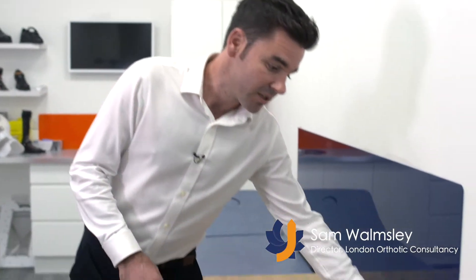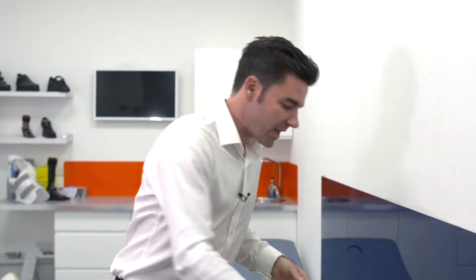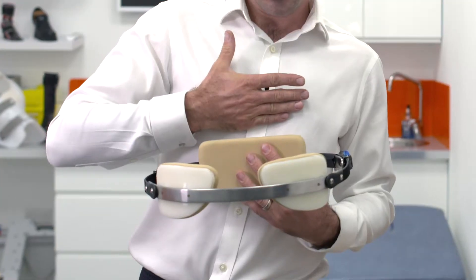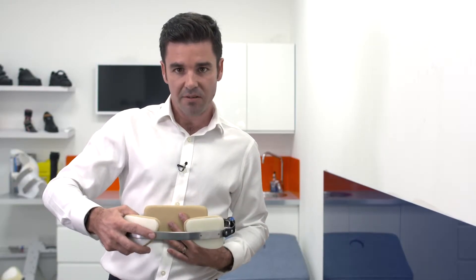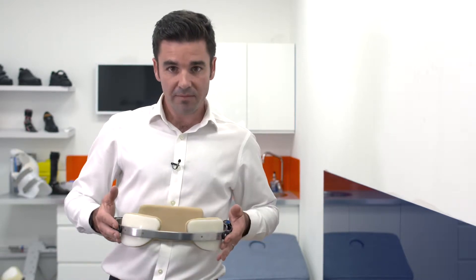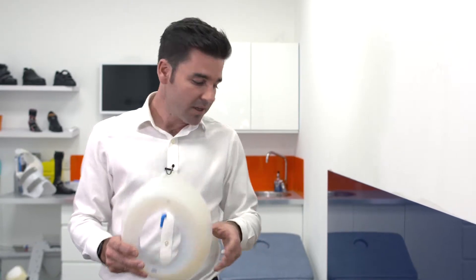With pectus carinatum, we treat with braces — typically a brace for the upper chest to push in the chest wall over a period of time. When you have pectus carinatum, you also get something called rib flaring, so as you push the upper chest in, the ribs come out. We use a rib brace on the lower ribs to correct that area as well. With excavatum, we use the rib brace over the rib flaring and then often a vacuum belt over the depression in the chest to pull the chest out.